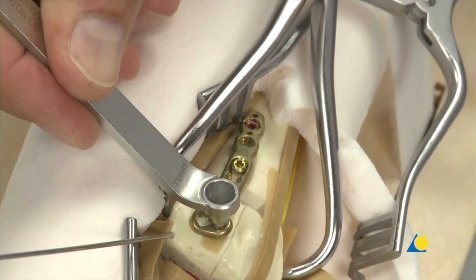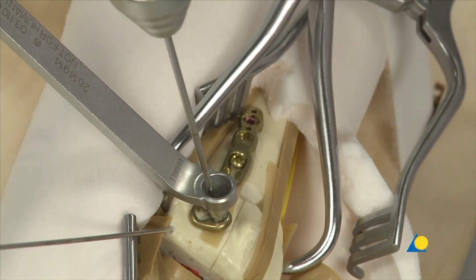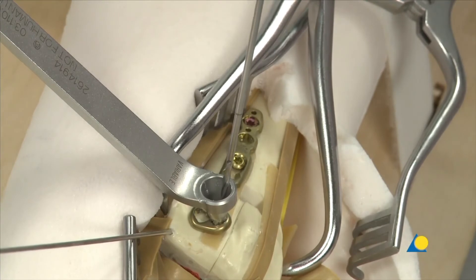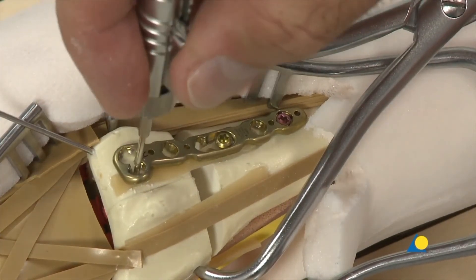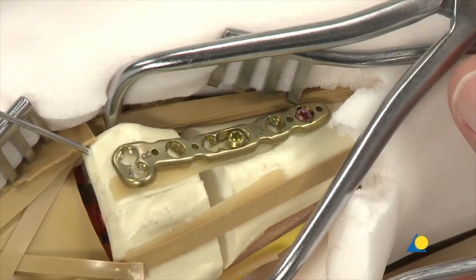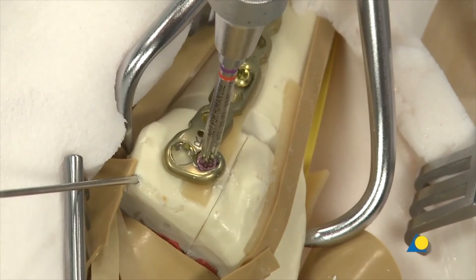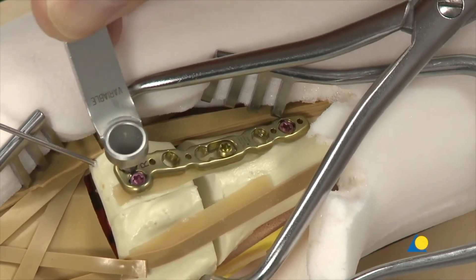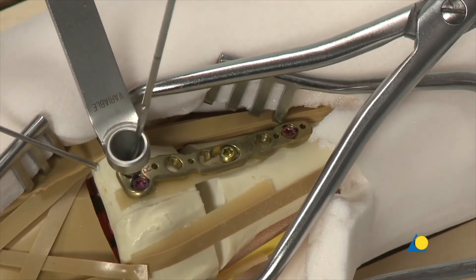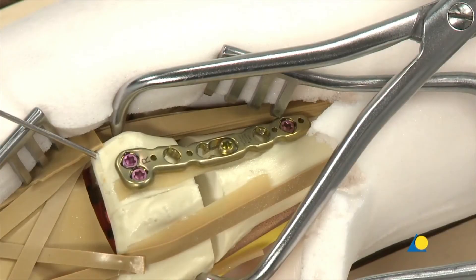The funnel-shaped end of the variable angle LCP drill sleeve is inserted into one of the plate holes in the distal arm of the plate. A hole is prepared with the 1.8mm drill bit at the desired angle, the depth is measured, and a locking screw of appropriate length is inserted and fully tightened. The process is repeated for the other plate hole in the distal arm: a hole is prepared at the desired angle, the depth is measured, and a second locking screw is inserted. The reduction forceps is then removed.